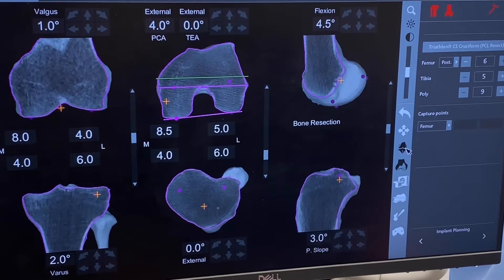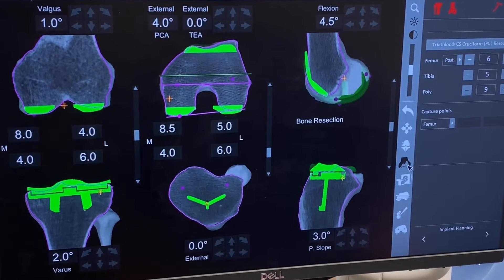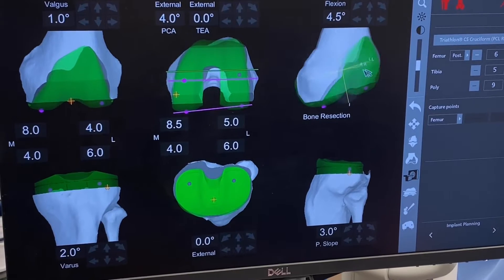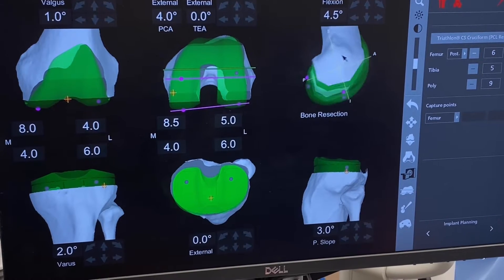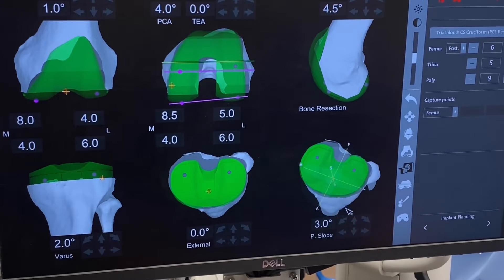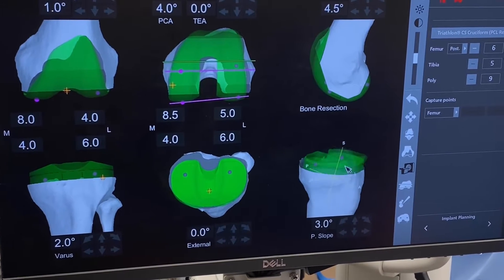We then get a chance to look at the knee and how it looks when we do a three-dimensional rotational view. That is exactly how you want your knee to fit on the end of your thigh bone. The tibia is pretty easy — that looks good too. Good plan.